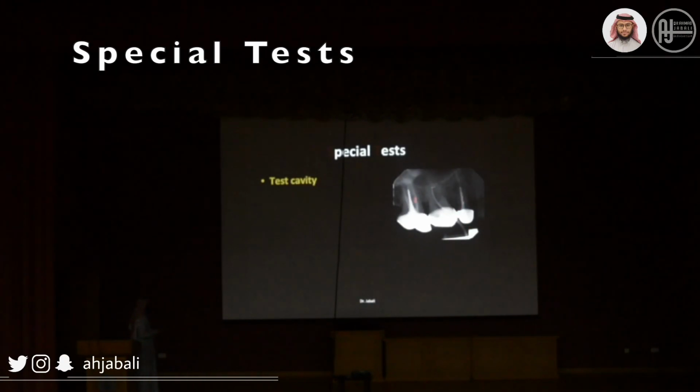If there is no lesion, but there is a stoma, like in this case, this is my case. We did a root canal for this tooth, and we found that the tooth is vital, and that the problem is not coming from the same tooth. It's coming from a different tooth, and we are going to see it, inshallah, in periapical surgery.